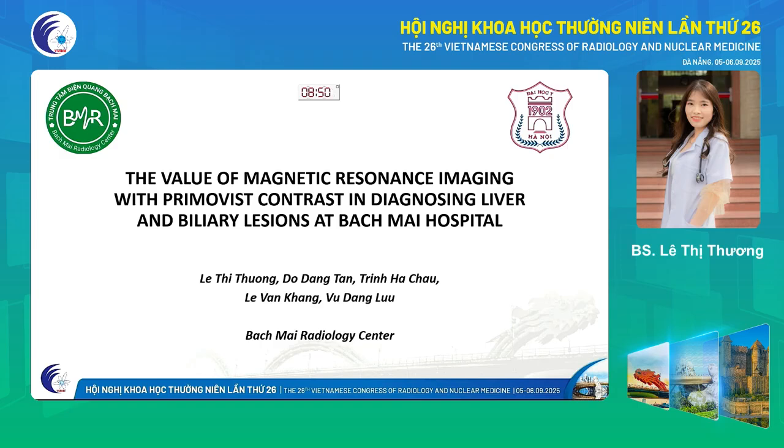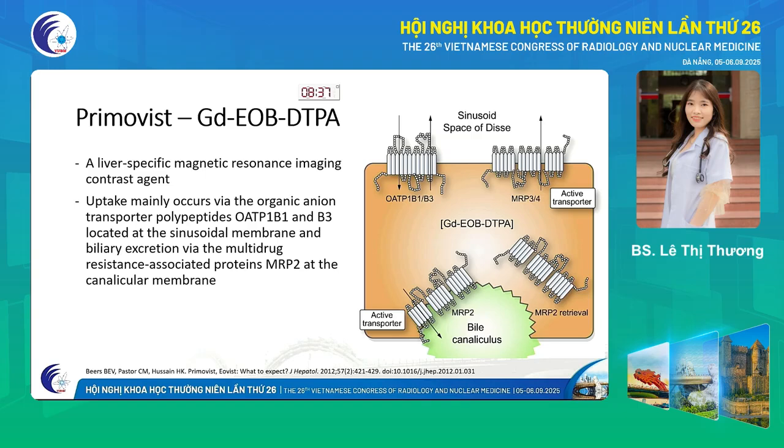My name is Thương, and I am pleased to present a report on the topic: the value of magnetic resonance imaging with Primovist contrast in diagnosing liver and biliary lesions at Bạch Mai Hospital. Firstly, Primovist is a liver-specific magnetic resonance imaging contrast agent.